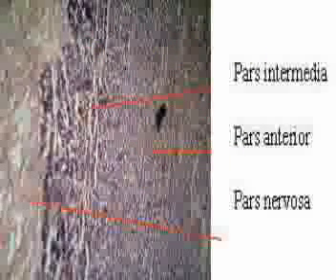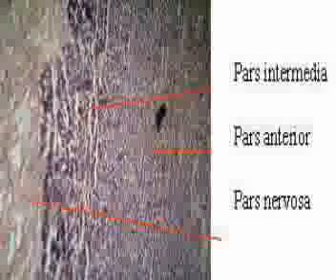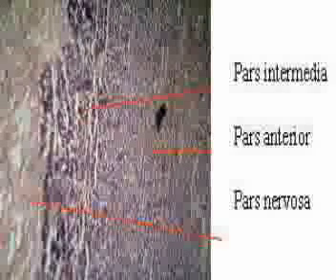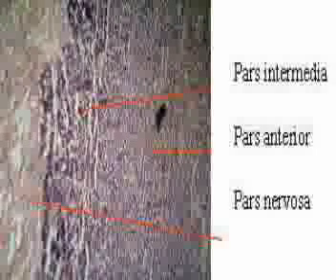The pituitary gland is divided into three parts: a pars anterior, which is the anterior lobe, a pars nervosa, which is the posterior lobe, and an intermediate area called the pars intermedia. Its cells form anastomotic cords and may be confused with the plates of a liver. It is a compact gland with little space between the parenchymal cells, but there is more space in the posterior part of the gland than its anterior.